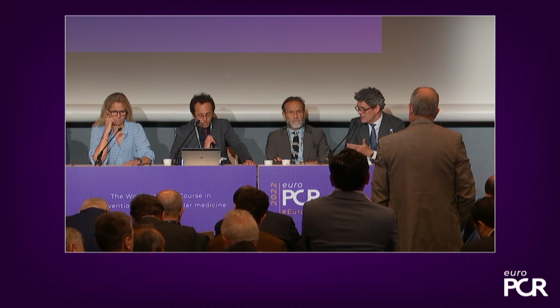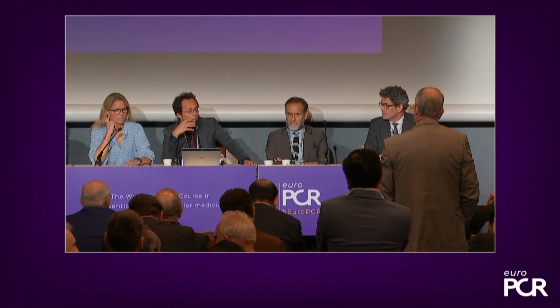We see that histologically. And when we're treating these patients, there's a consistent behavior of when you're applying sufficient shocks at an area of nodular or eccentric calcification, that calcium is being modified. And modified in a predictable way sufficient to allow full stent expansion. I think this is the take-home message here for me. What I've learned new is that on these calcified nodules and eccentricity, you probably really try to get the most impulses there and to be more efficient.